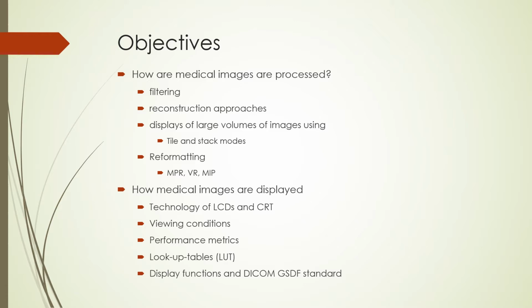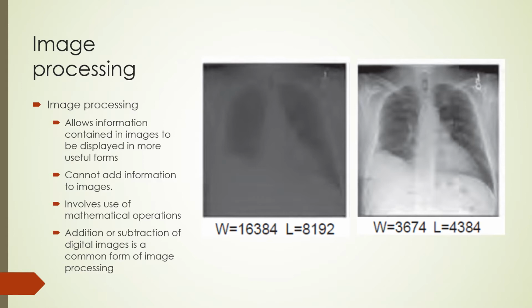The second group of objectives is to learn about how medical images are displayed. We will look at the technology of cathode ray tubes and liquid crystal displays, and also their viewing conditions. We will also look at performance metrics and enhancements using lookup tables. We will spend some time on display functions and the DICOM GSDF standard. So let's start with image processing.